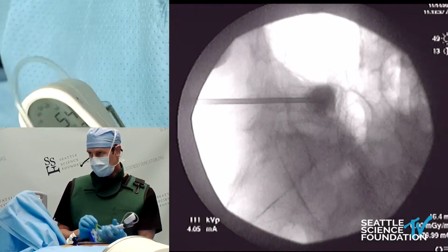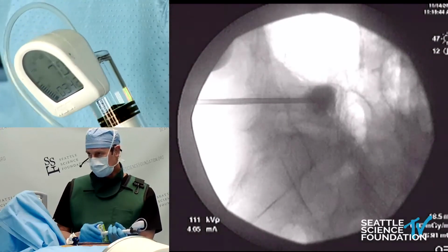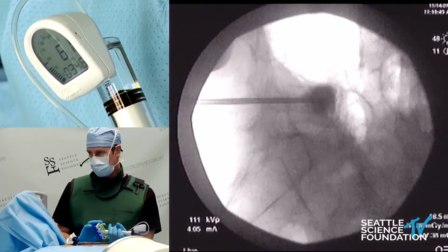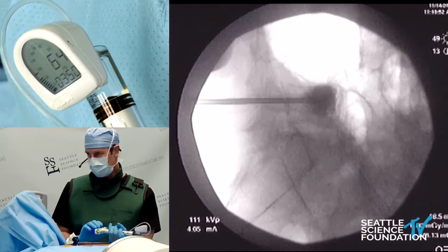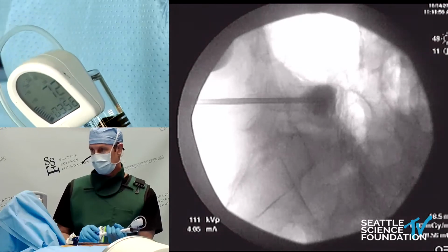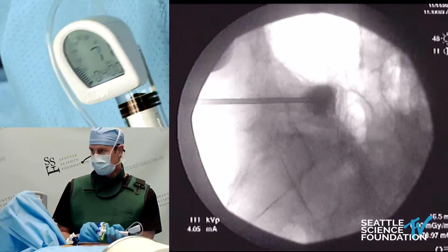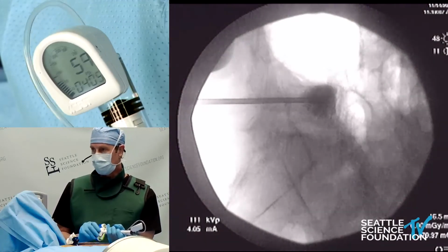And so, kind of approaching the end of the procedure here. Nice cavity, nice fill, very nearly end plate to end plate. Good cement viscosity. The other characteristic, meaning the balloon tends to stay where it is, is called compliance. It is a low compliance balloon.